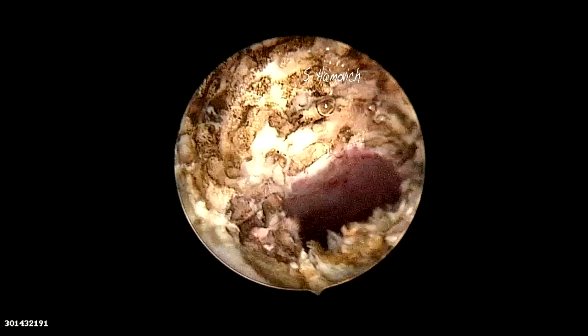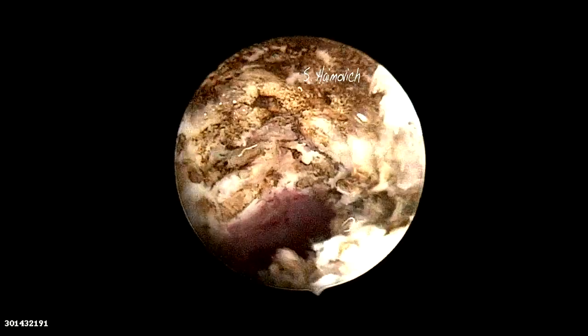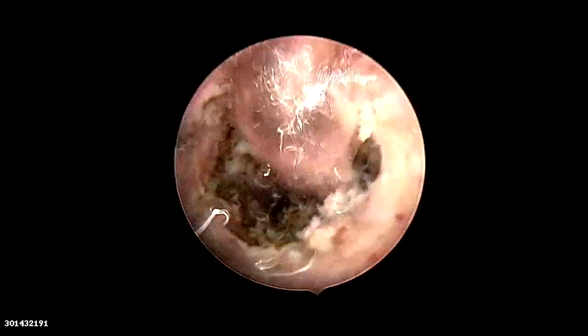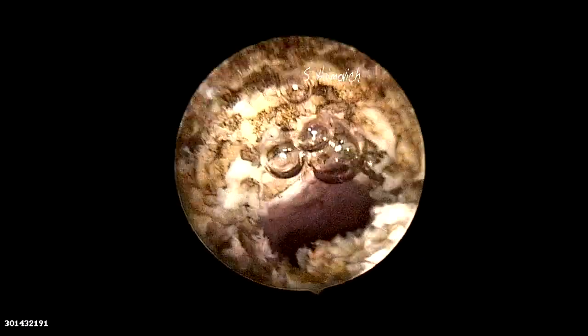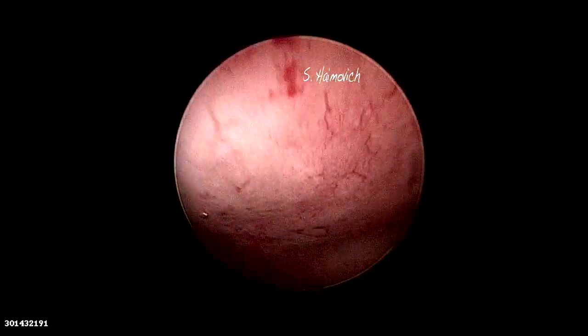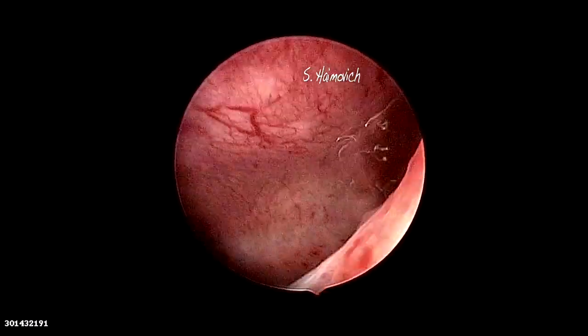Now the final results are seen: 360 degrees of ablated tissue and an open isthmocele connecting to the uterine cavity.